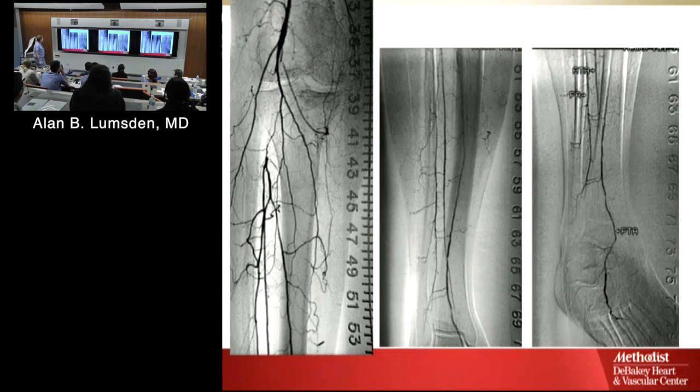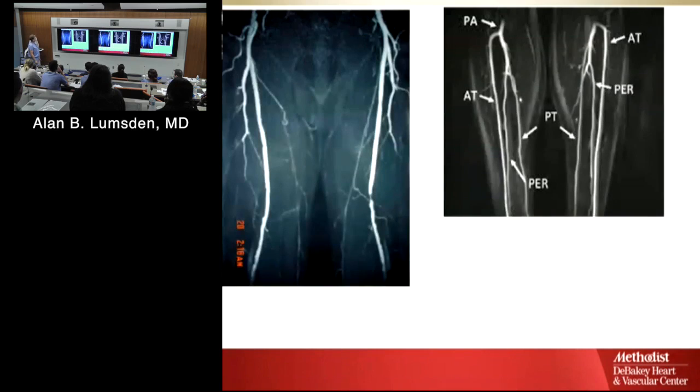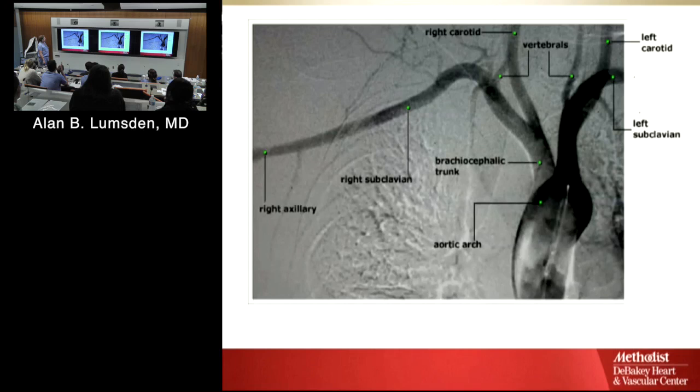You can't see it here, into the plantar arch. There's a plantar arch and plantar branches basically down inside the foot. It's easy when it's all laid out like this for you. So you can get the same anatomy, in this case basically it's off an MR. Okay, nice, we have labels. I think we've done all of that stuff.